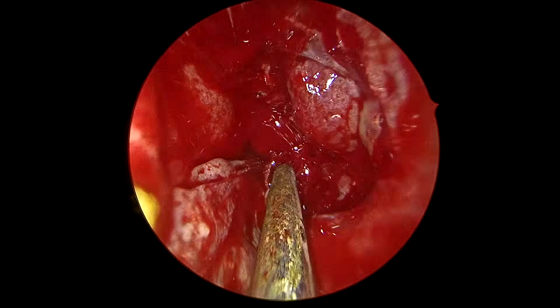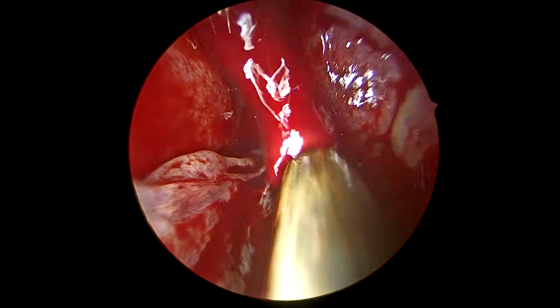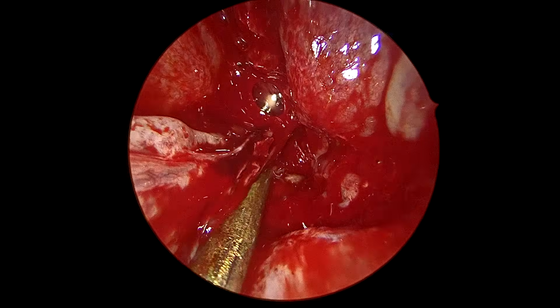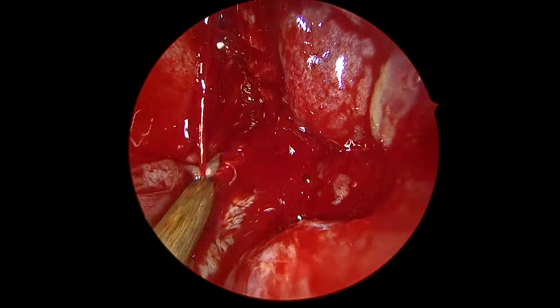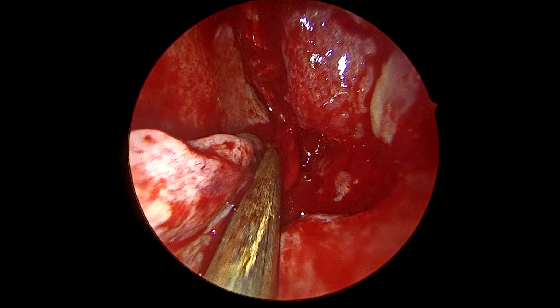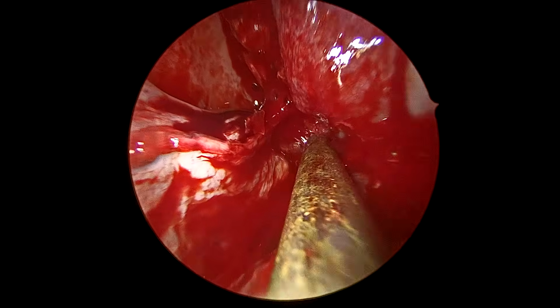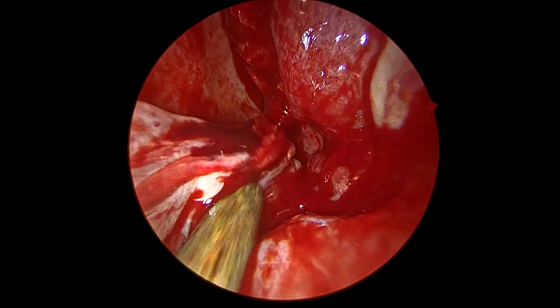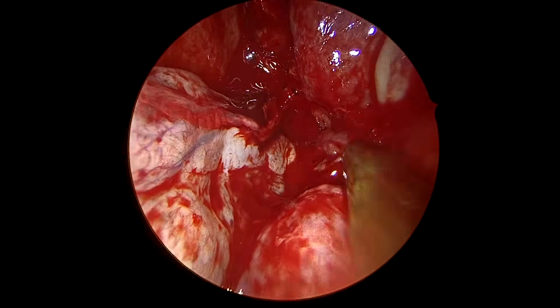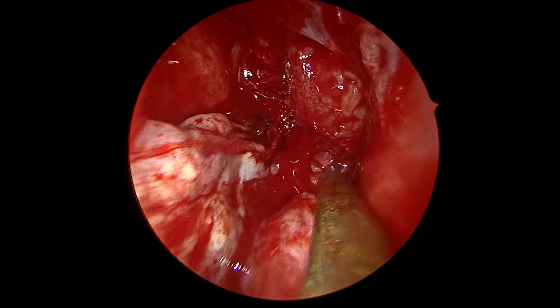So you see, I have removed the vertical part of the middle turbinate, and now you can see the mass is going toward the posterior fontanelle, towards the region of the attachment of the middle turbinate and the inferior turbinate. So basically it's an inferiorly placed mass. It is not attached to the lamina papyracea or the posterior ethmoids or other important structures, which are the sphenoid and posterior ethmoid basically. Once I ascertain that this mass is not attached to important structures, I can take it out completely.